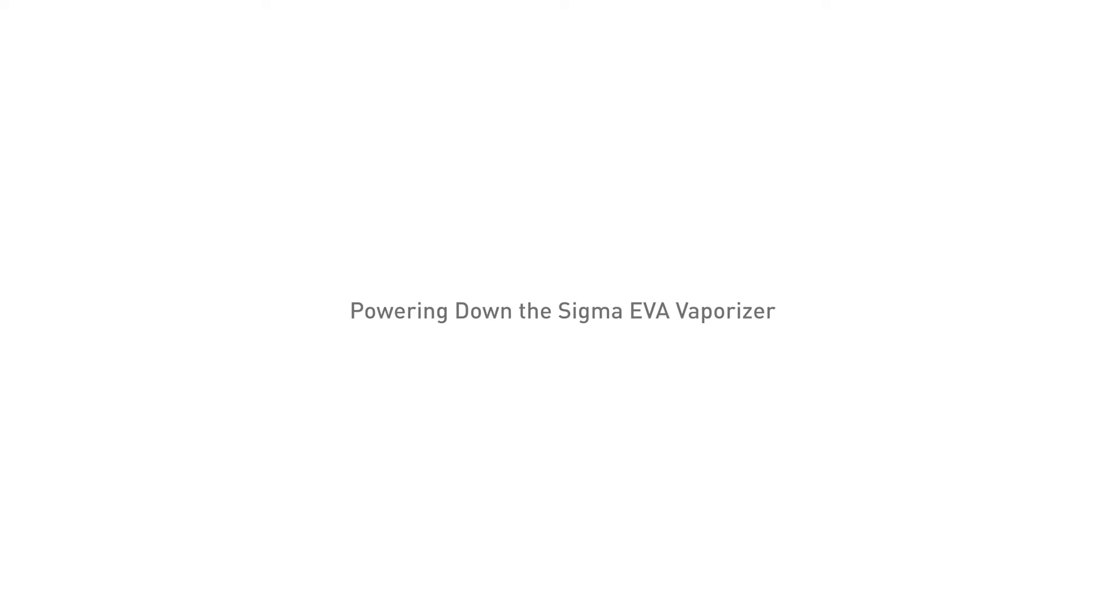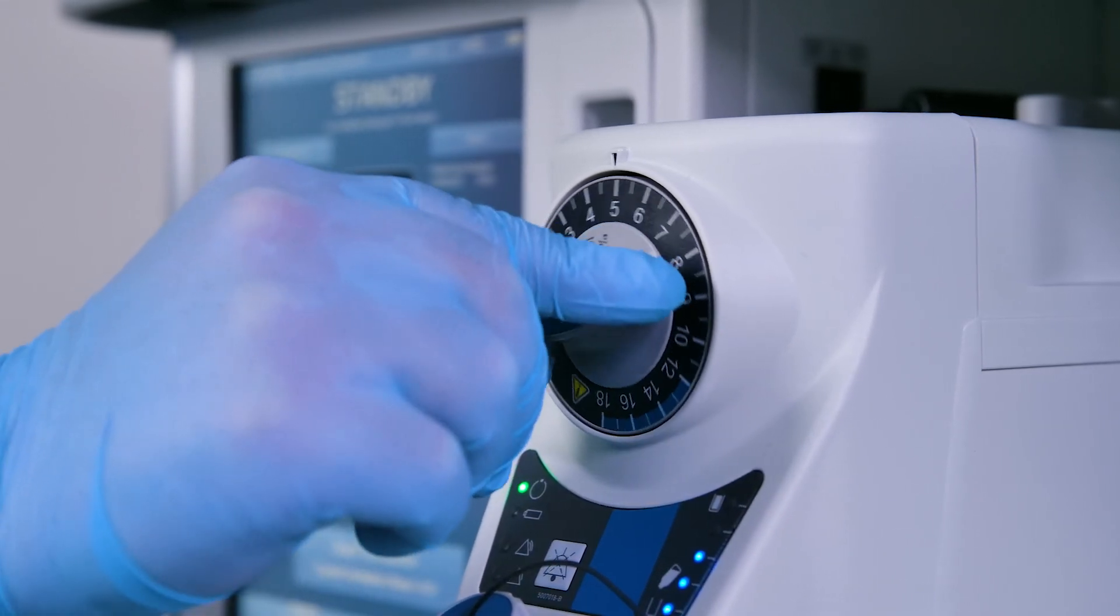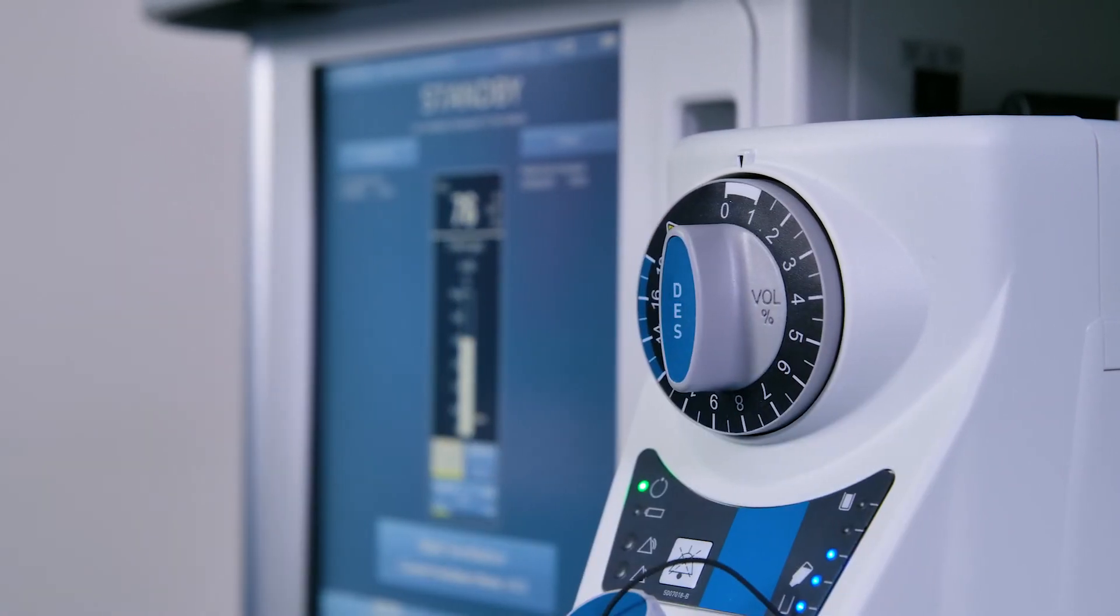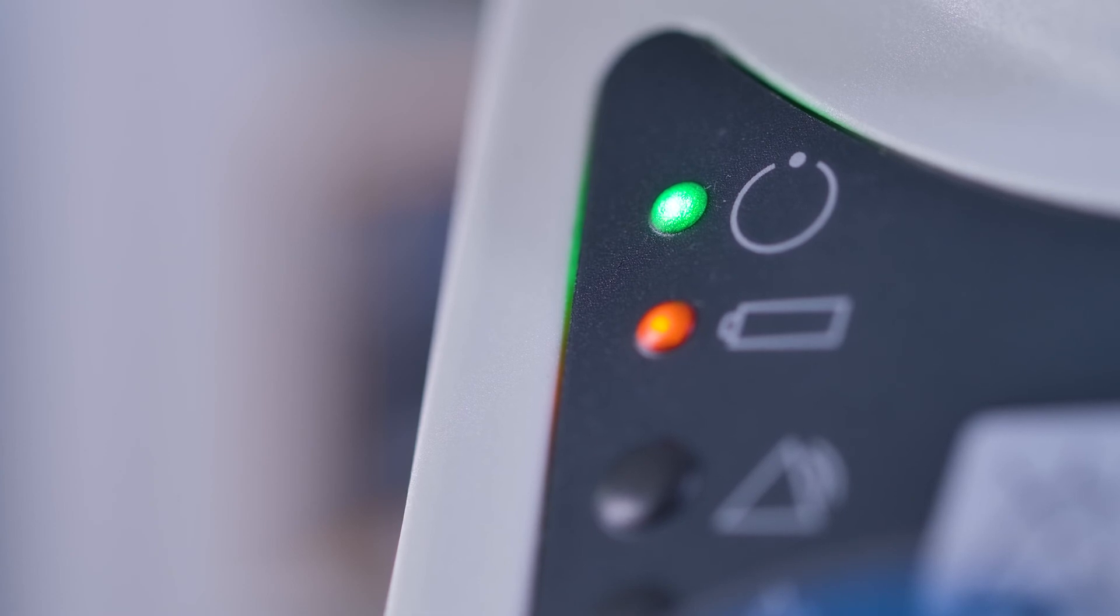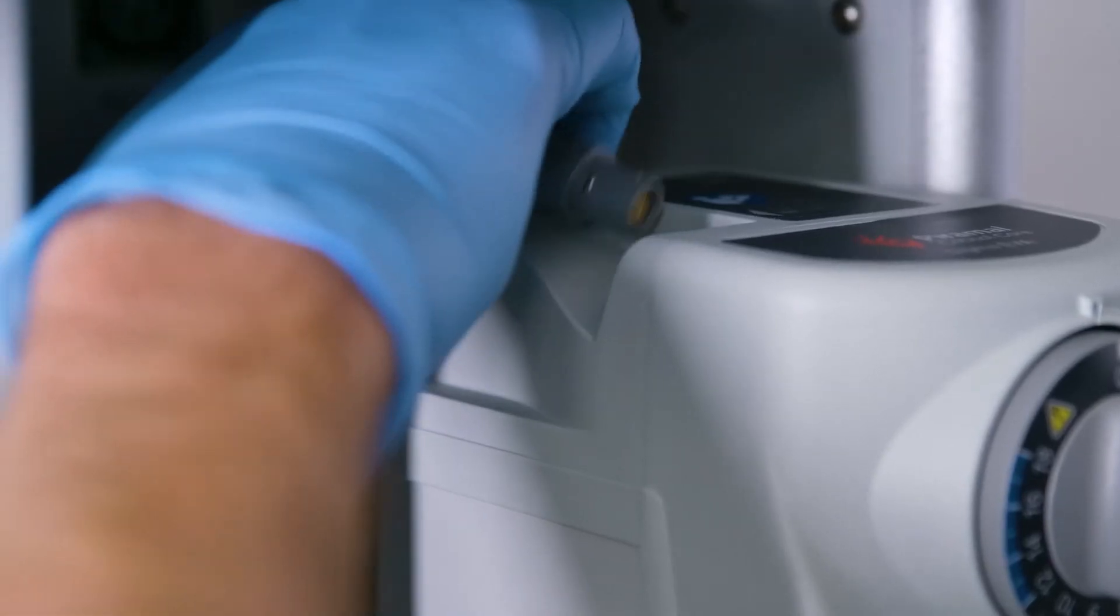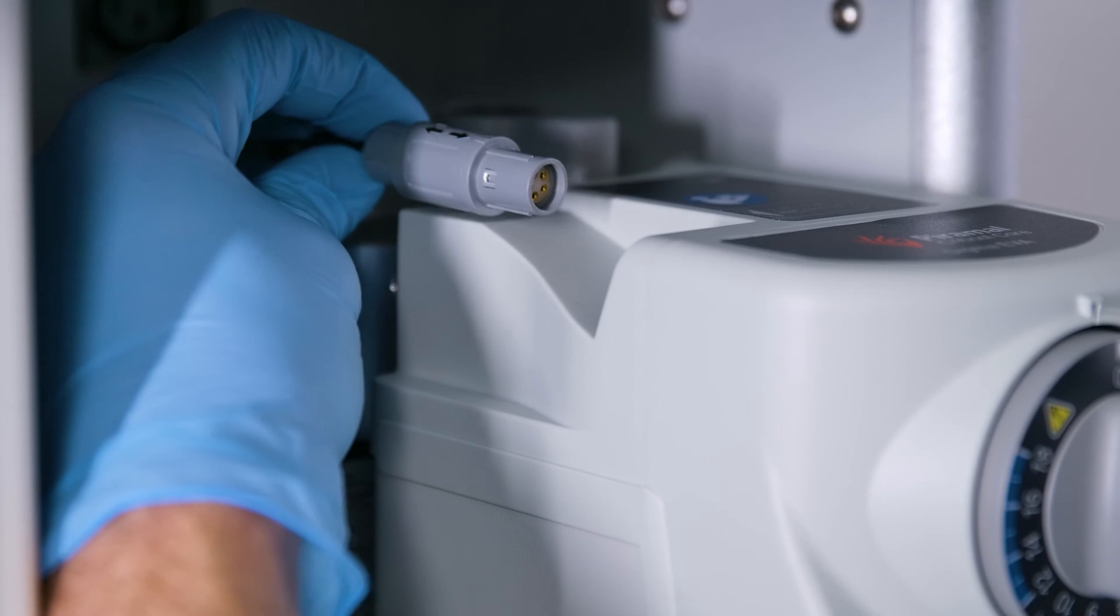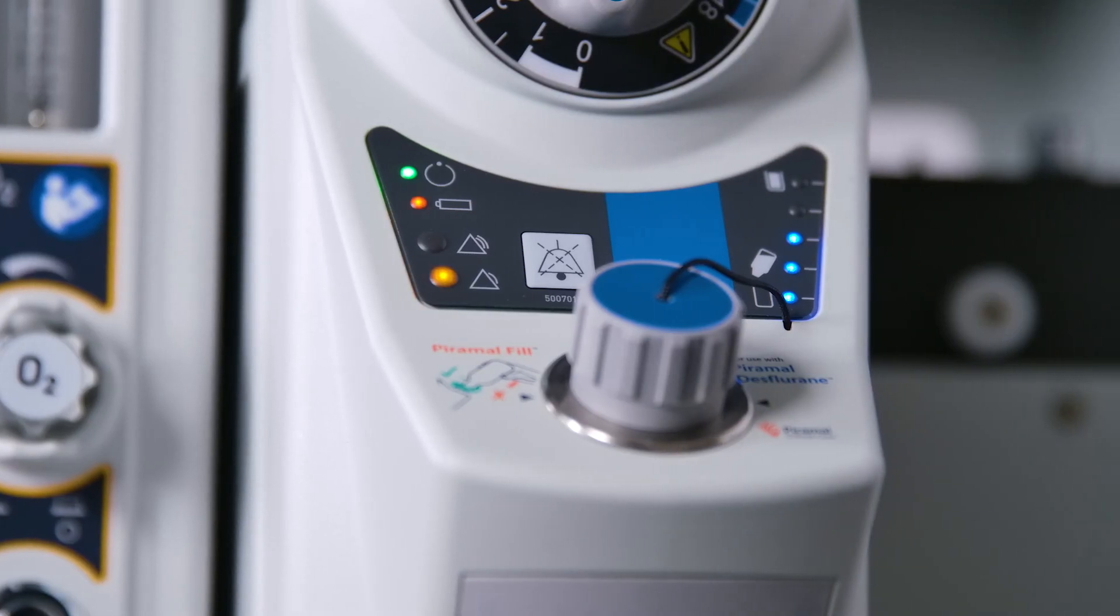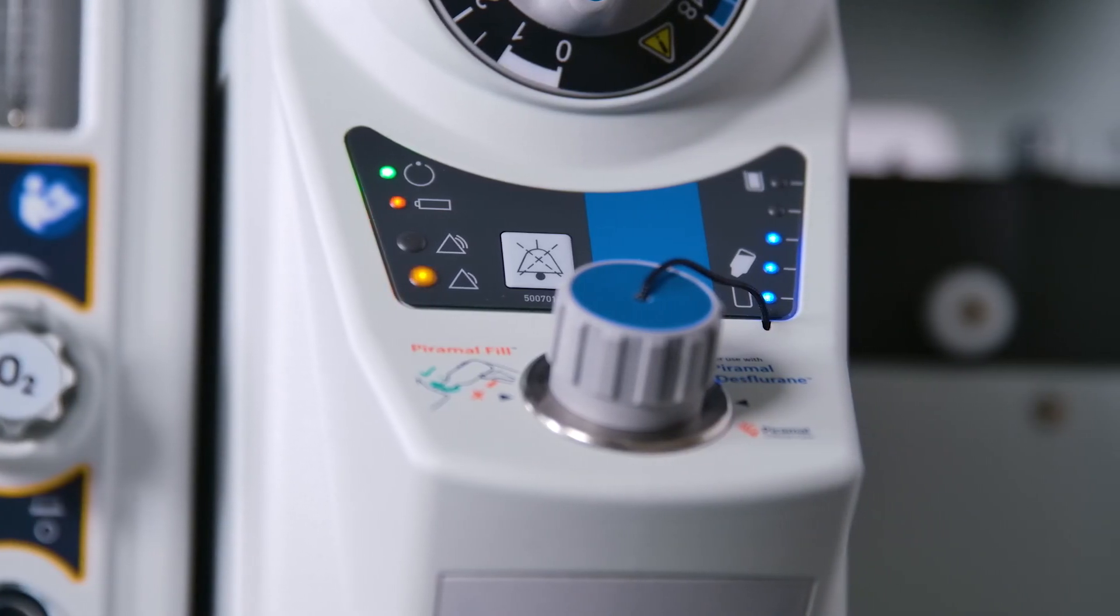Powering down the Sigma EVA vaporizer. Set the concentration control dial to the 0% position. The vaporizer will revert to standby mode. Disconnect the electrical power supply cable. The vaporizer will automatically exit operating mode and power down.